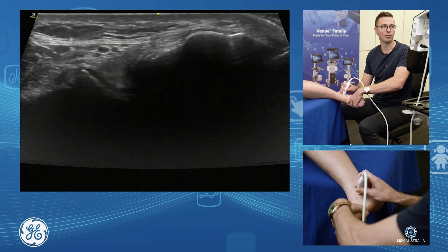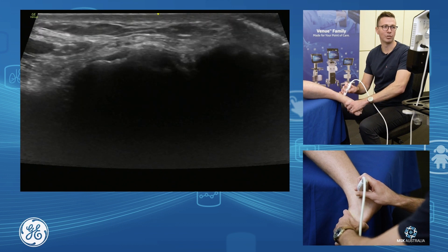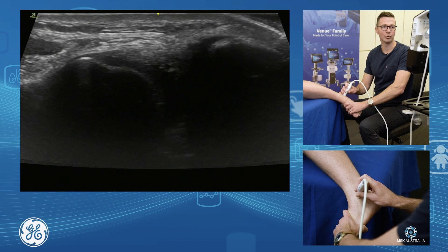If you take it off tone - if the foot's dorsiflexed - it boils itself up, wraps itself up. So you need it on tone, you need it stretched out. A bit of plantar flexion, a bit of inversion, and you see your ATFL nicely.